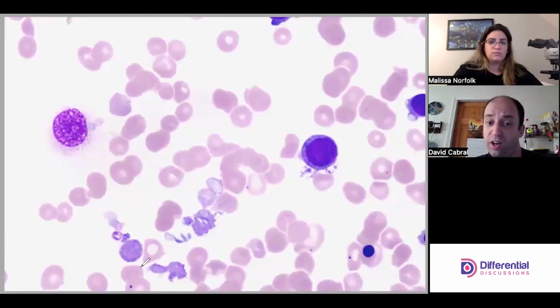If it looks like a duck, quacks like a duck, right? So these being abnormal looking platelets, it should be noted to some degree as the procedure will dictate, because it's good for a clinician to know that you might get a platelet count, but maybe those platelets aren't great. Well, I think that depends on the institution, because some institutions wouldn't report platelet counts. They would put UTR, which is unable to report.